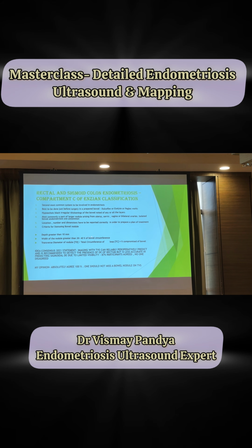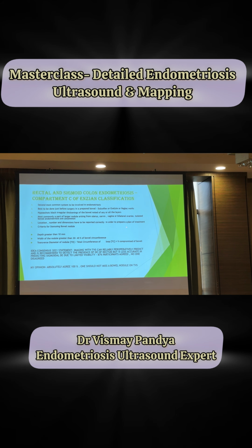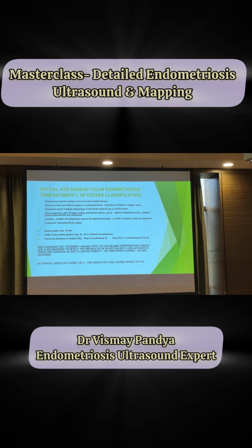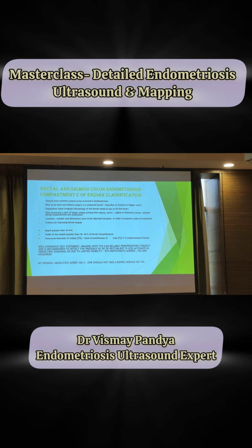This is to be done only and only if there is a large plaque, like the plaque of the nodule is around 5-6 centimeters, and you want to know, because the plaque will be large, the depth would be around 7 to 8 millimeters, borderline.